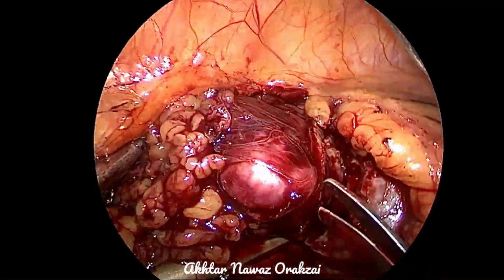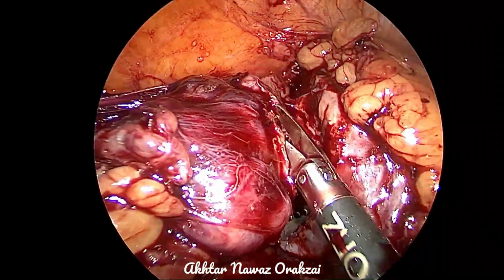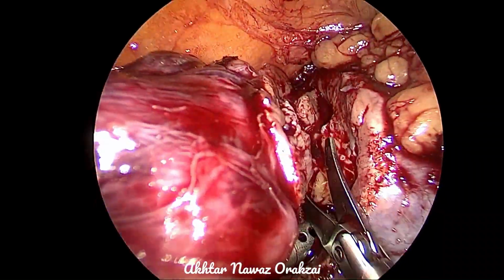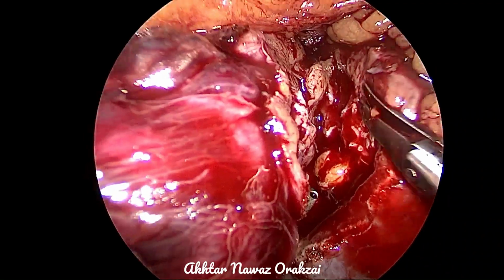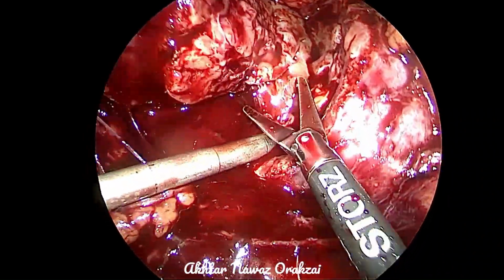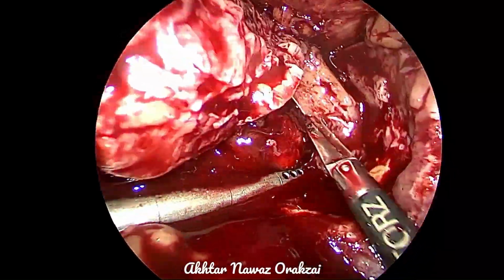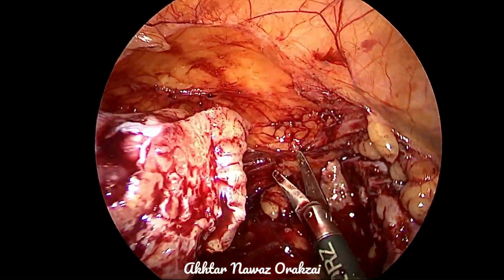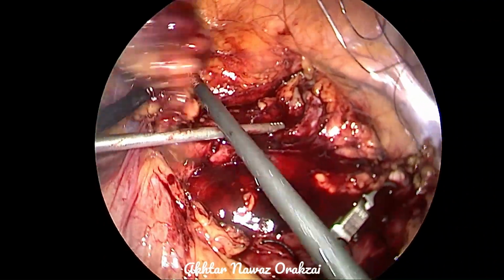And we have dissected deep enough, and the cyst has not opened, and that was the aim. Here we can see that the lower pole calyx may have opened. Yes. So the tumor has been separated.